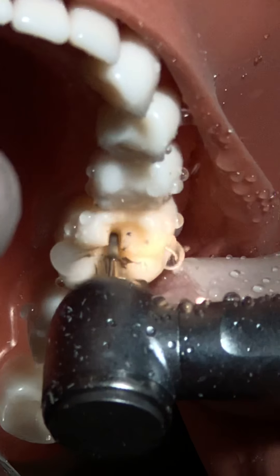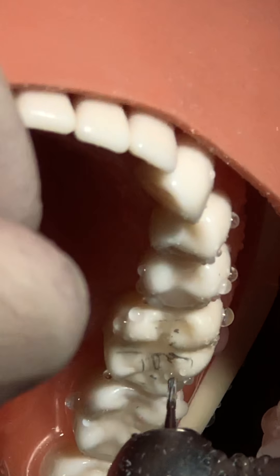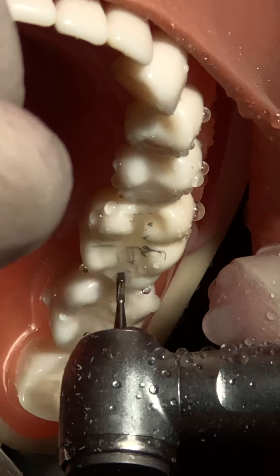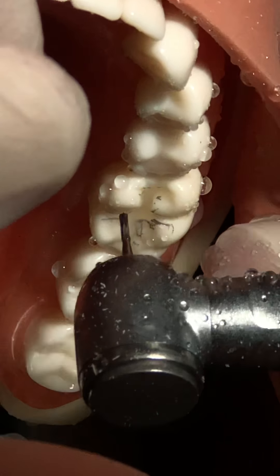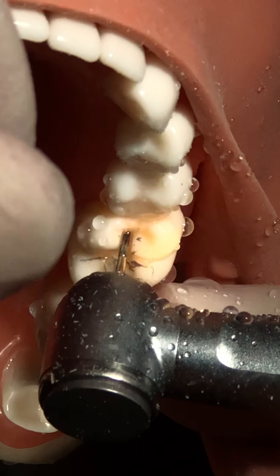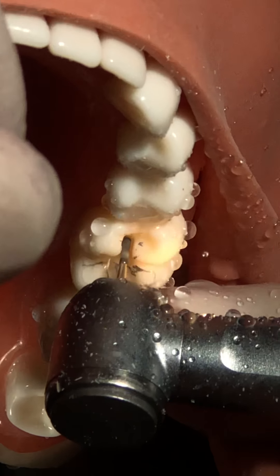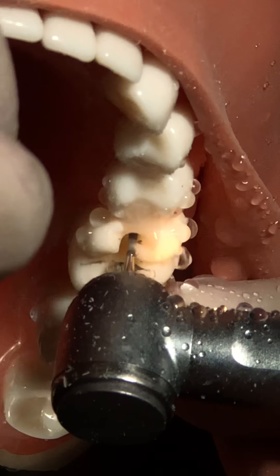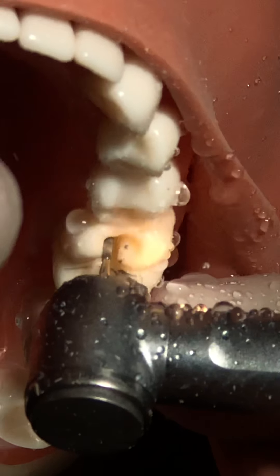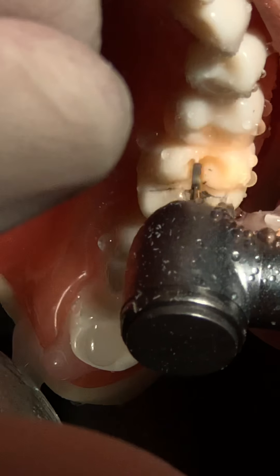The bur should always be perpendicular since we are going to break the margin. We keep it perpendicular unless preparing a cavity where we are not breaking the margin - in that case we slightly tilt it so the margin is not undermined. Here we are removing the margin, so we keep it straight. The depth here is all right but slightly less in some areas, so we'll even it out.